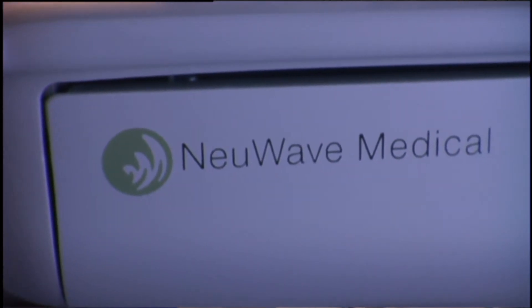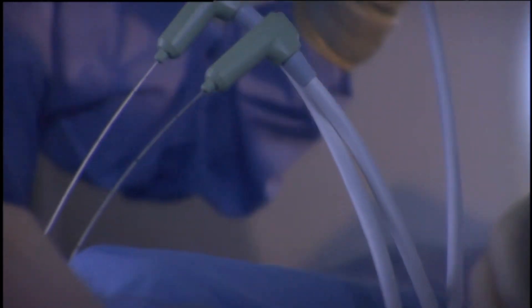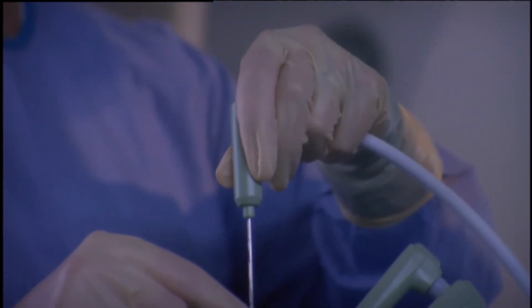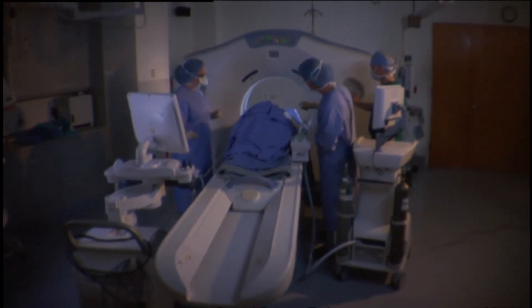Here at New Wave, we've developed something that we call the pod. The pod is a device that clips onto the CT table, the ultrasound bed, or even onto the operating table. There is a single cord that comes from the machine itself into the pod. The pod then acts as the power distribution station, and you can plug probes into the pod and then place them in the patient. By clipping directly onto the CT table or ultrasound table, if the patient moves into a CT scanner, the pod moves with the patient, minimizing the risk of pulling probes out of the patient during the procedure.